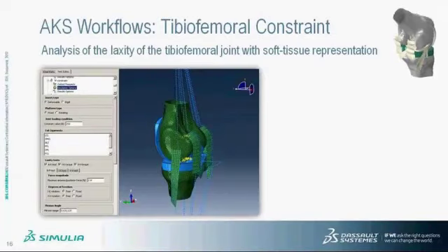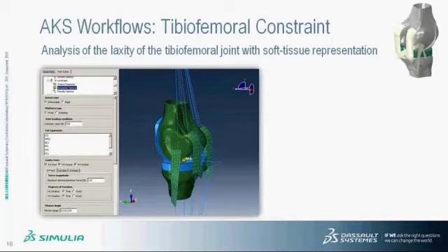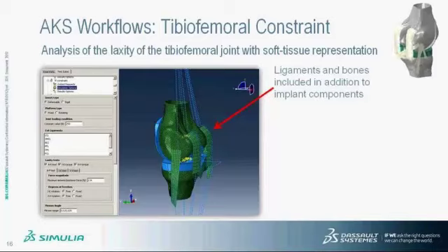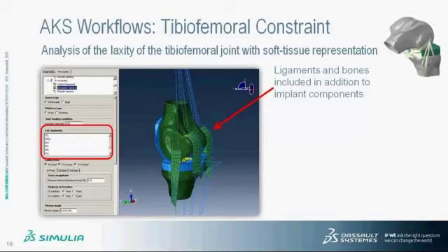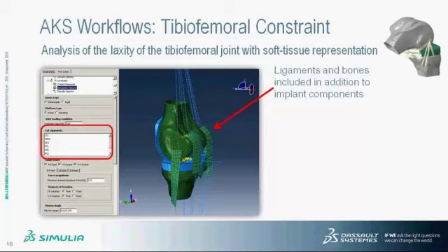The third workflow is the tibial femoral constraint workflow. This is the analysis of the laxity, just like the previous workflow. However, in this workflow, the tibial femoral joint with soft tissue representations is included. That includes ligaments and bones around the knee joint. And the user can selectively cut ligaments to represent surgical removal of these soft tissues or clinical weakening of some of these soft tissues.